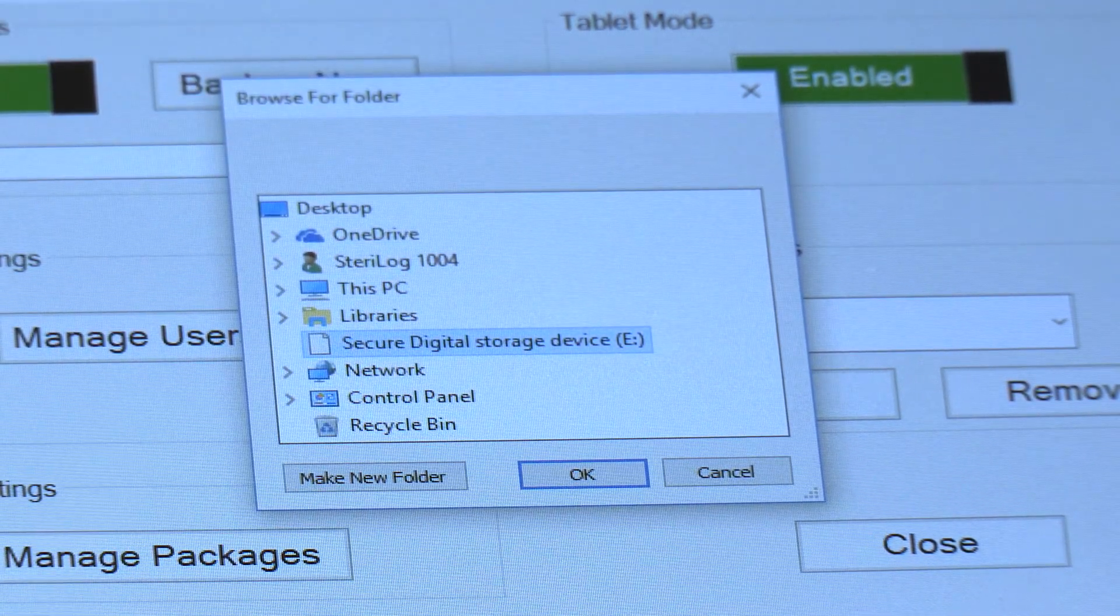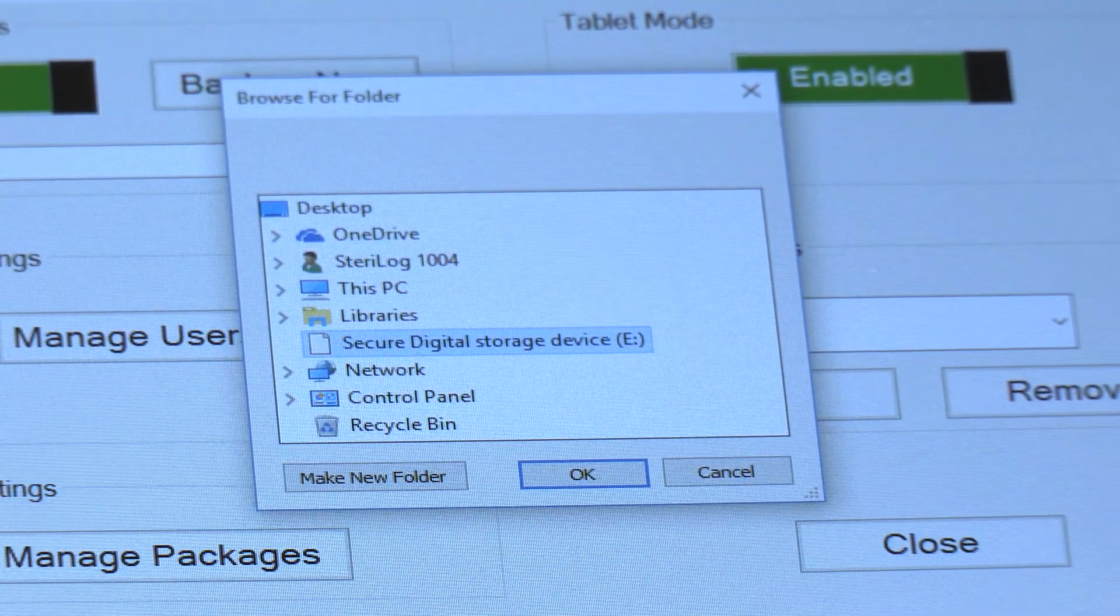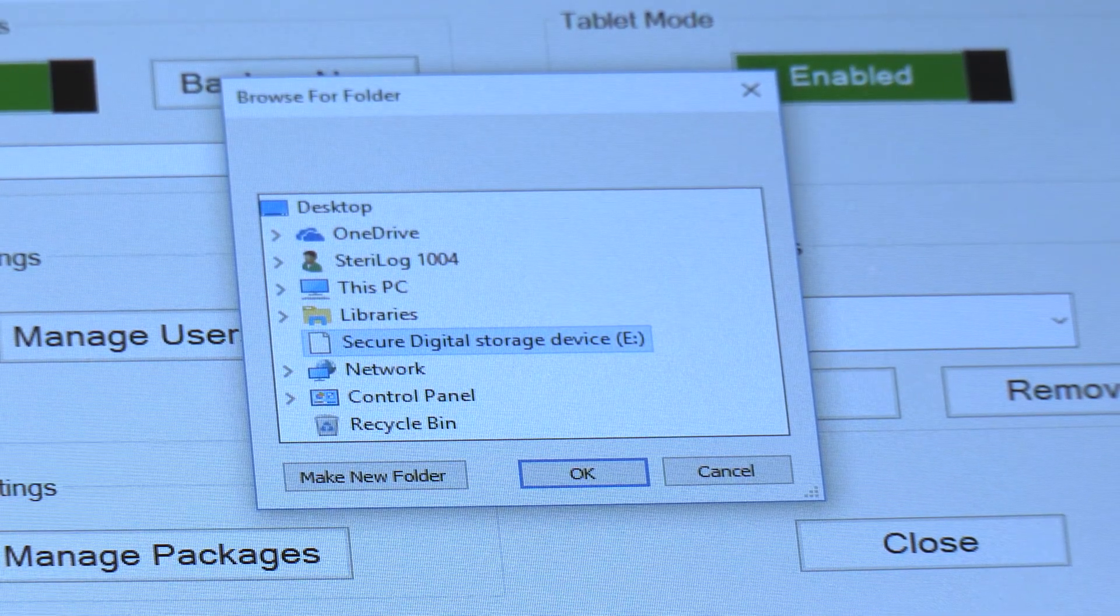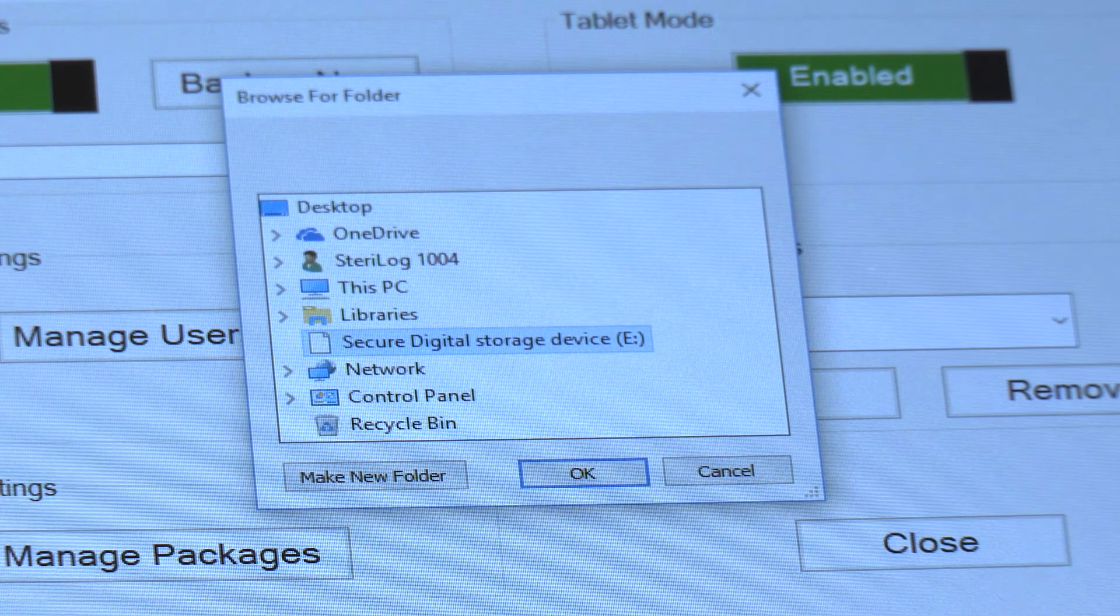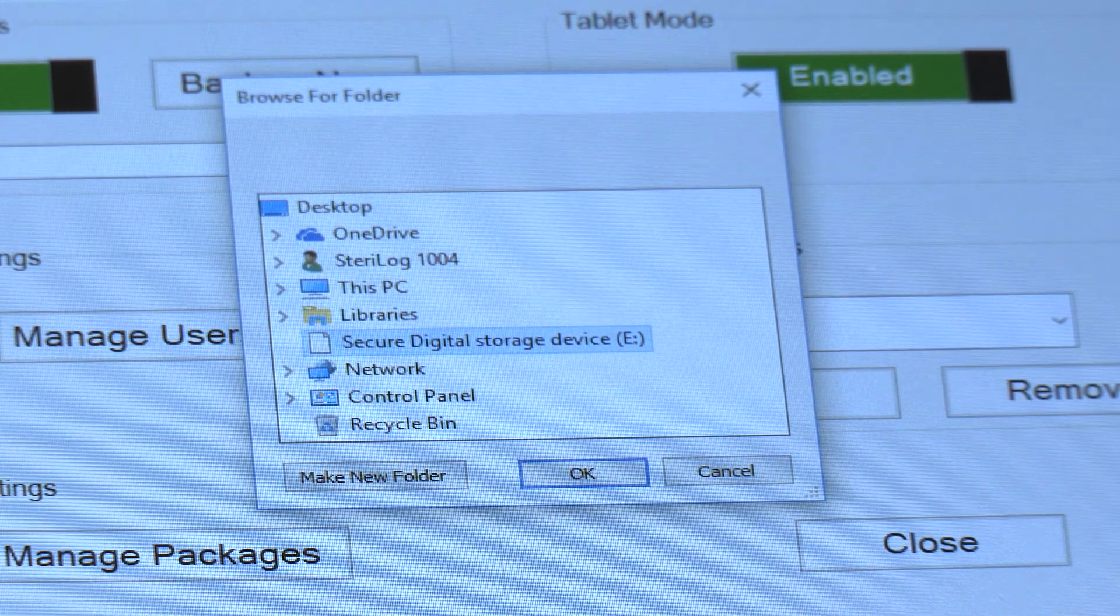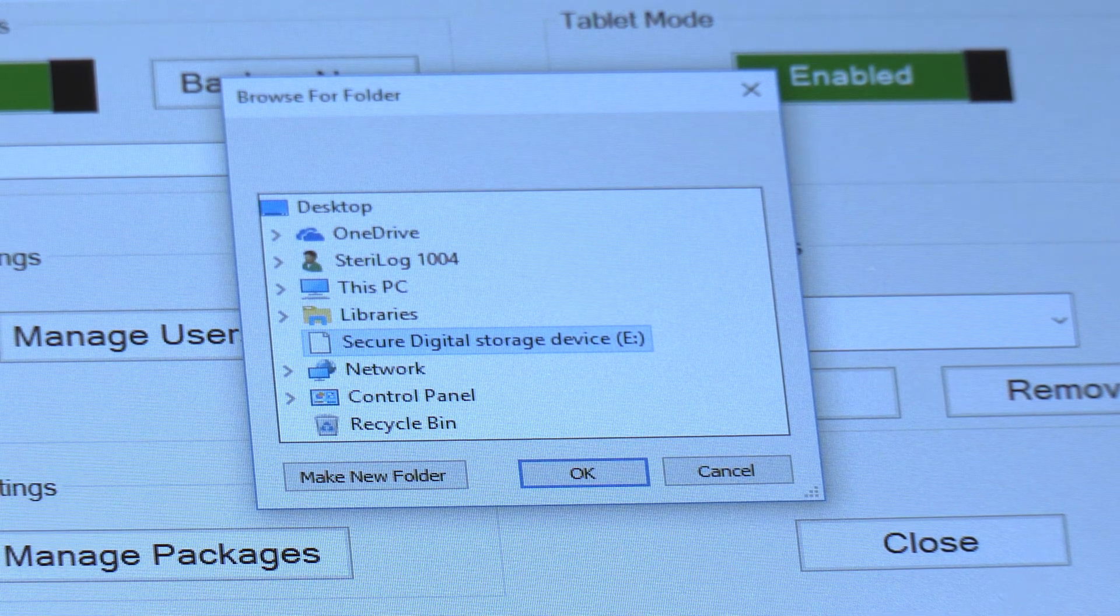Or you can similarly set up a cloud location such as Dropbox or OneDrive for your backups.